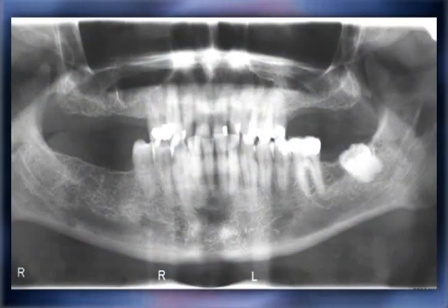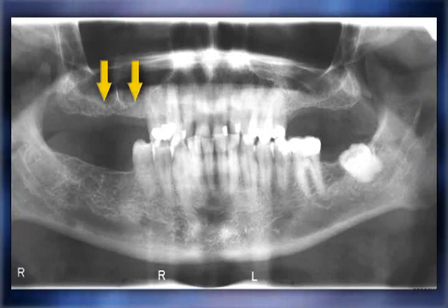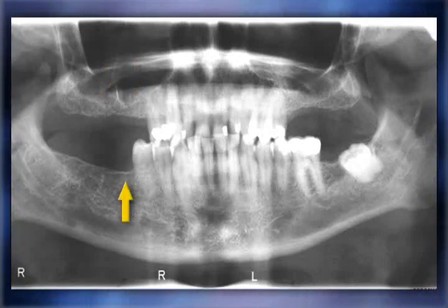The patient to be treated in this demonstration is a 41-year-old male with multiple missing teeth, including the maxillary right second premolar and first and second molar teeth. The plan was to replace the second premolar and first molar teeth with 2 7-millimeter long Endopore implants and 2 separate non-splinted crowns. In the opposing arch, the patient was missing the molar teeth, and of these, the first molar was to be replaced with a single Endopore implant and a single crown.